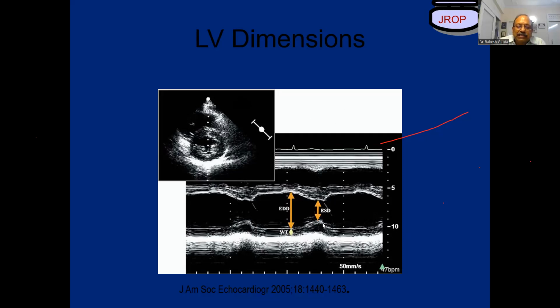Look, the LV wall thickness will have a contraction. Can you see this contraction? Yes. Second thing is, it's the endocardium and myocardium which thicken over a period of time. So what we look for is a thickening of the endocardium, which will give you a difference. Now, where's the posterior wall? Look at this separation over the wall over here. Behind it is the posterior wall. Another way of differentiating pericardium versus LV wall is to reduce your gain completely. Once you reduce your gain completely, the myocardium and endocardium will disappear and you'll only see the pericardium.